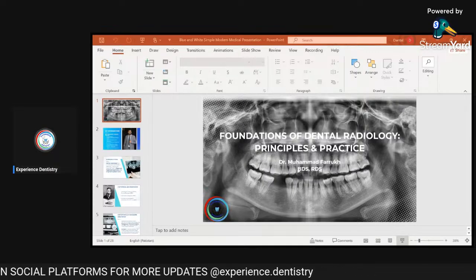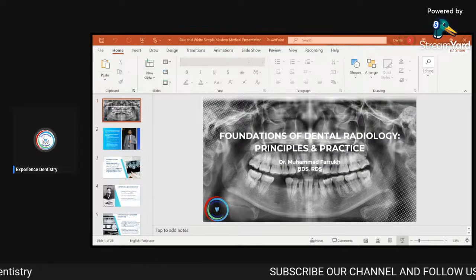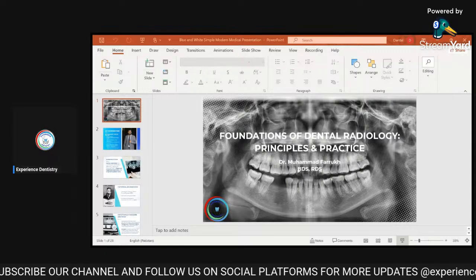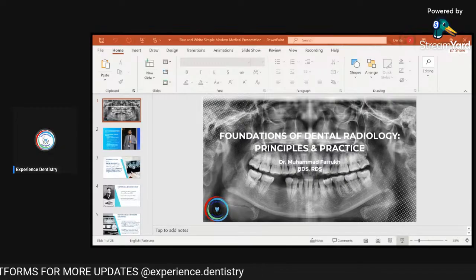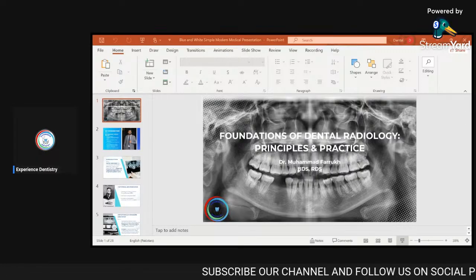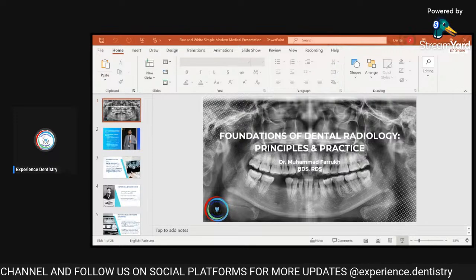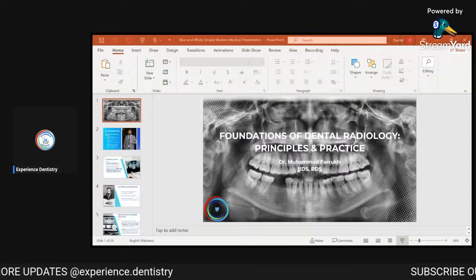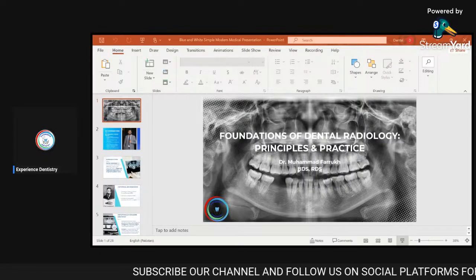Okay. Then we use radiographs to detect pathologies like cysts and tumors. You can see in this picture there is a very big radiolucency. The structures that appear black are called radiolucent, and the structures that appear white in the dental X-ray are called radiopaque. So you are seeing radiopaque crowns in this picture, and the root canal of one lateral incisor. You can see that there is a root canal done in white color, and both centrals have a central hollow. You can see it is a hollow circular radiolucency, which is basically a... Can you guys detect what this is?